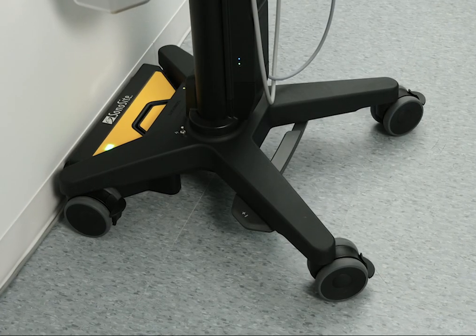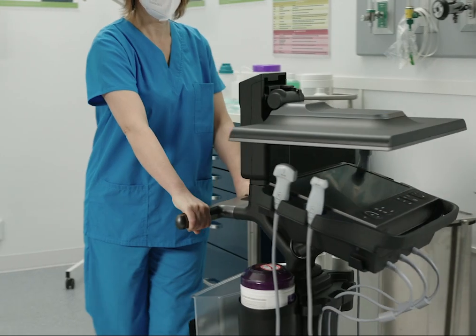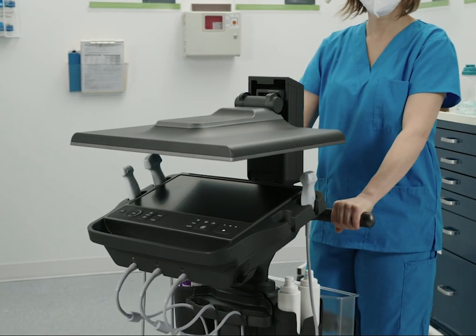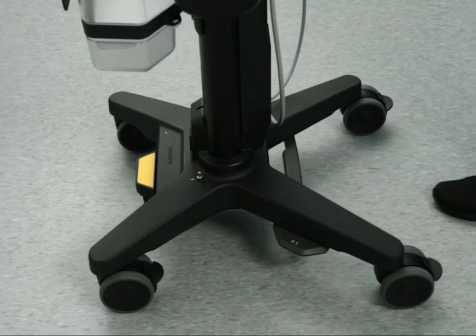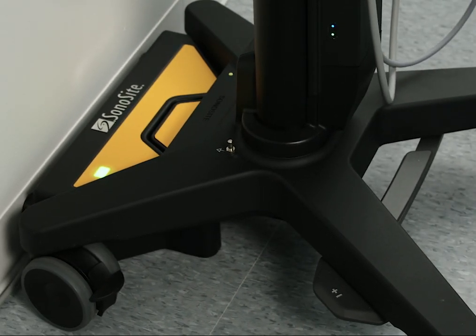A convenient way to charge your system is by using the Sonosight PowerPark. Before transporting your system, make sure to fold the clinical monitor down. Then wheel your system to the PowerPark module and push the back of the stand into the dock, making sure that the stand clicks into the dock.